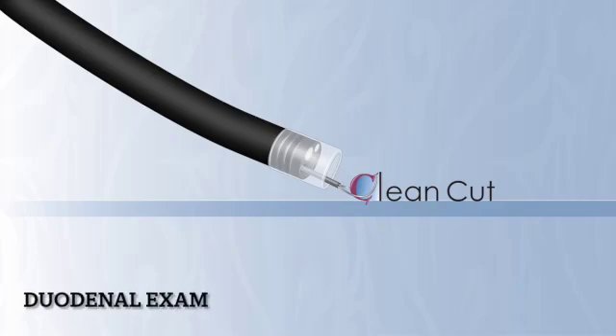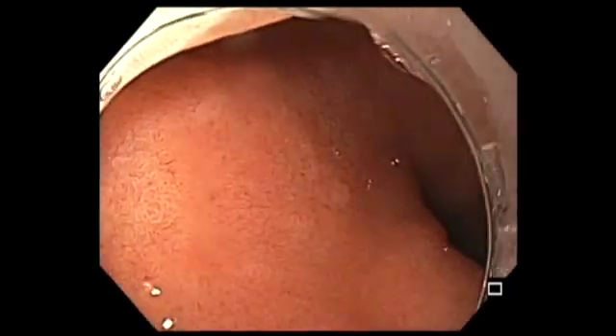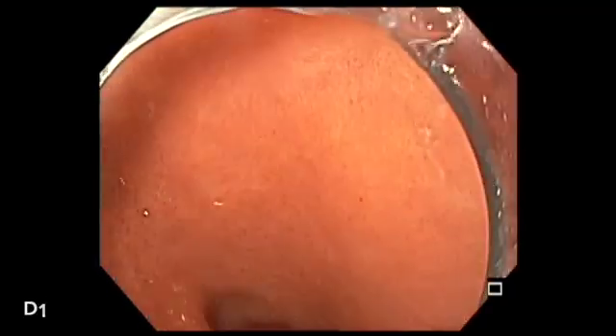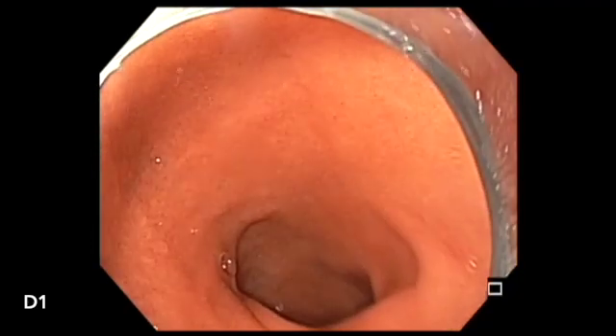Let me share with you how to perform a duodenal exam. Here you notice a cap-fitted endoscope entering the pylorus, and we are now in the first portion of the duodenum.